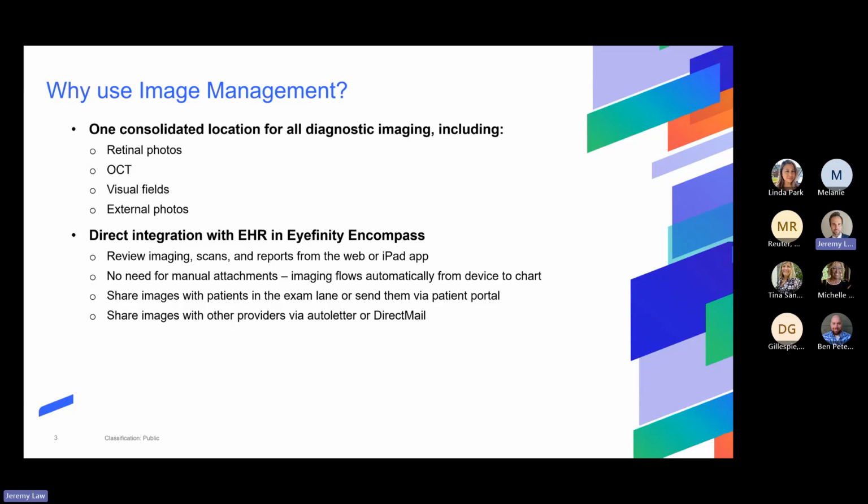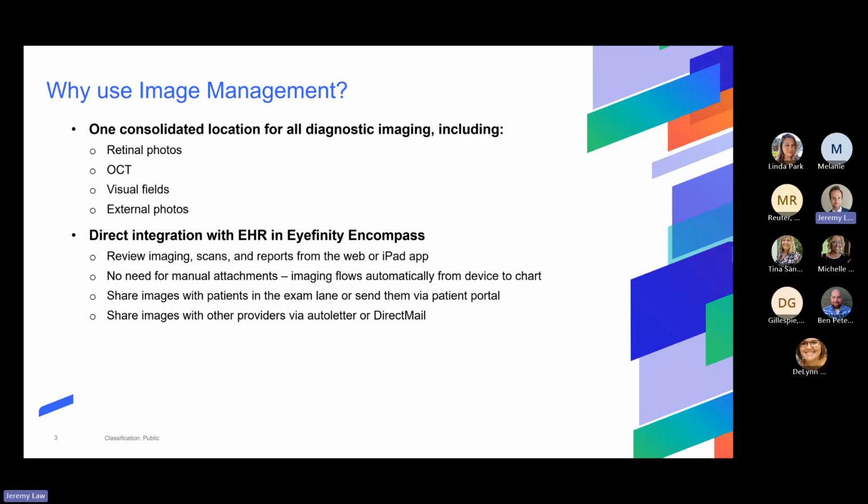Also, the ability to share images, like I mentioned, is something that's easier to do with image management. For example, if your patient is in the exam lane and maybe you've got a patient who has diabetic retinopathy, they're in the early stages, and you can see progression year over year, but they're maybe not being compliant, they're not watching their blood sugar. You're able to just turn the iPad to them and show them the progression of their symptoms year over year. And I think that's really powerful. When I talk to doctors who use image management, they say that wow factor of being able to essentially just turn the device to the patient and show them side by side is really powerful.